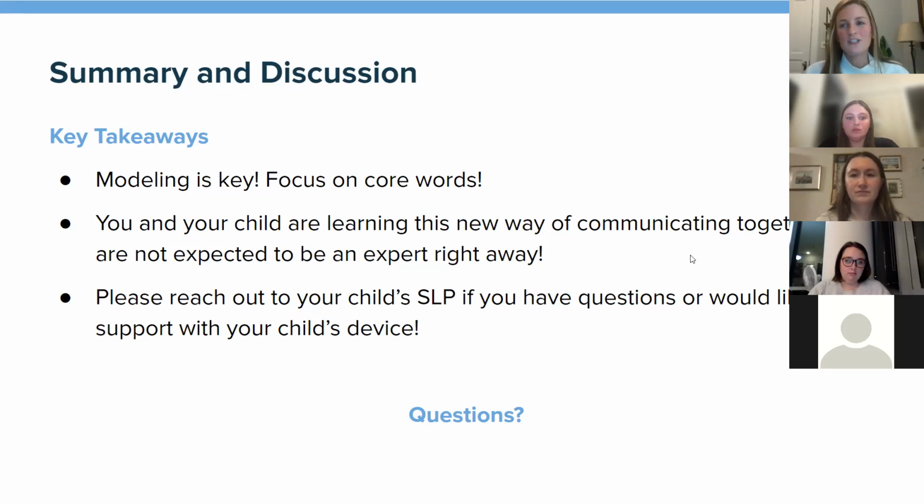So really just modeling, touch those talkers, touch those devices as much as you can, and just making sure that they're always out and available in case our kids want to use them. And just know that you are learning with them.